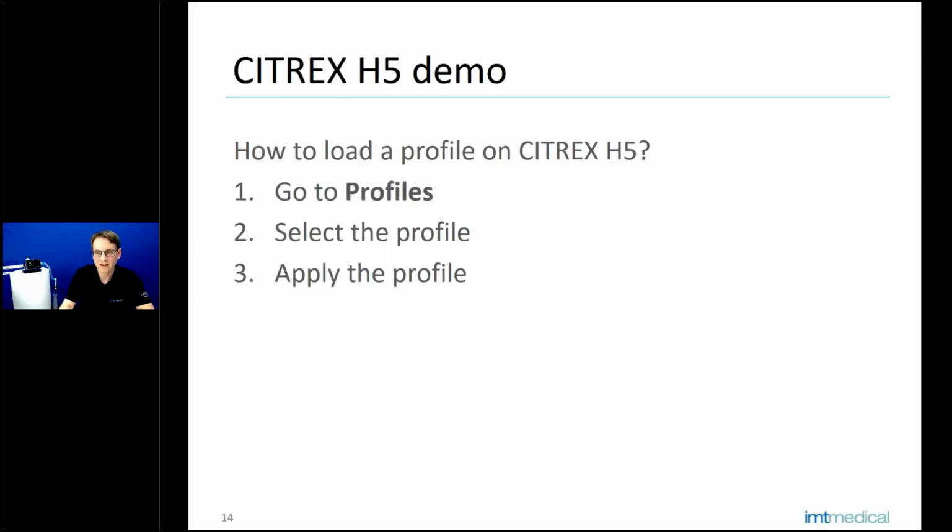So let's have a look how I can do this on CITREX H4, because this is completely different. I have a CITREX H4 here with me too. And with H4, it is not possible to create the profiles on the device itself. Here it works differently. We have to create the profile on the SD card of your CITREX H4.